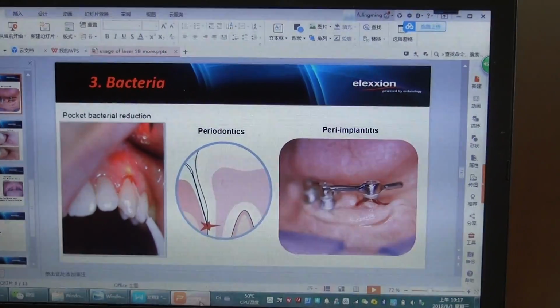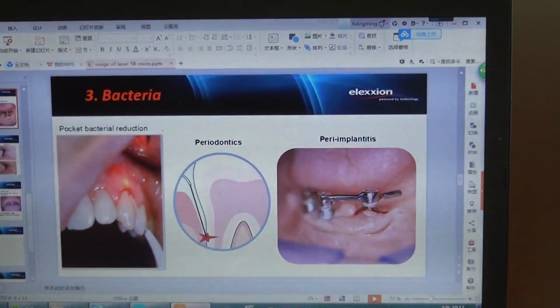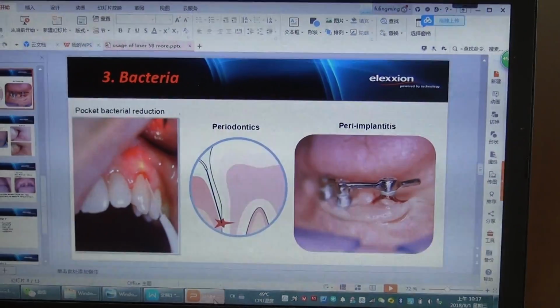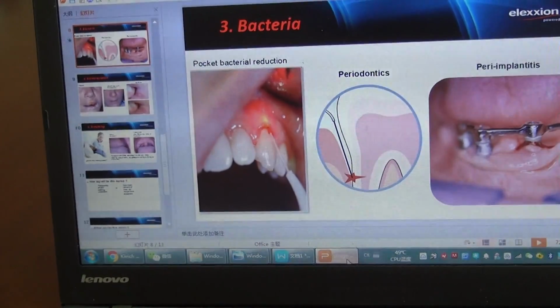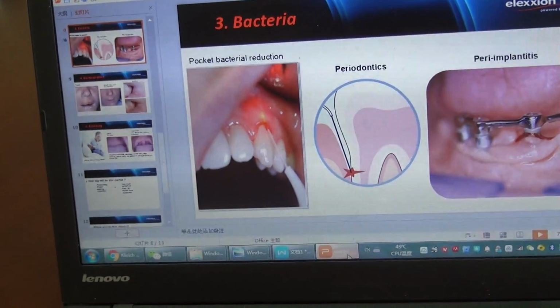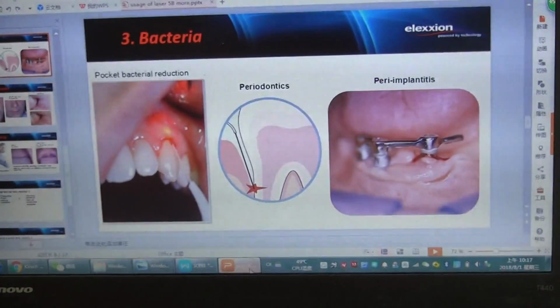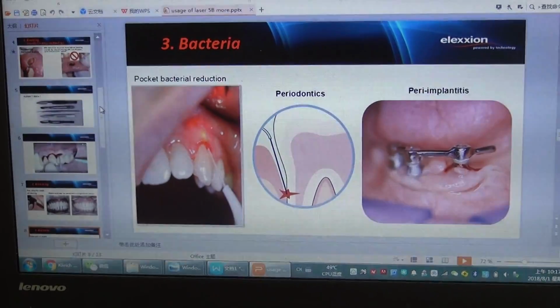So the second idea of this video is, I really want to know who is the first person in Korea who realized that Mectron's piezo surgery is a useful tool for doctors.